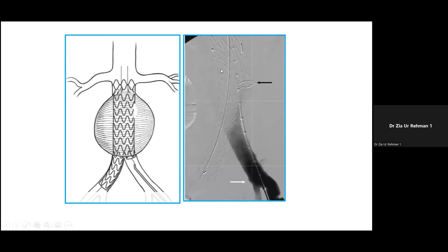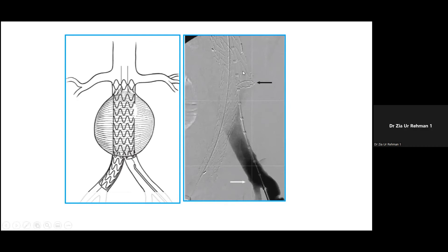Here the main body is open, the contralateral gate is visible, and the pigtail catheter and super stiff guide wire are in place. To confirm the wire is in the contralateral gate, rotate the pigtail catheter inside — if it rotates freely, the catheter is confirmed to be inside the contralateral gate.